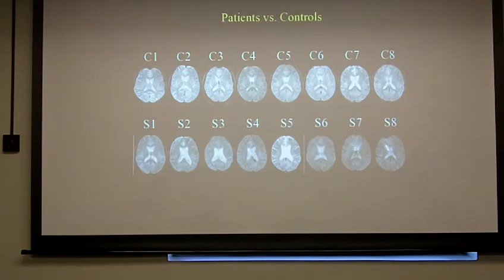Then I can run statistics and ask whether that patient's superior frontal cortex activates more in this condition than yours. If that's your research question, then the closer the size gets, the happier you will be.